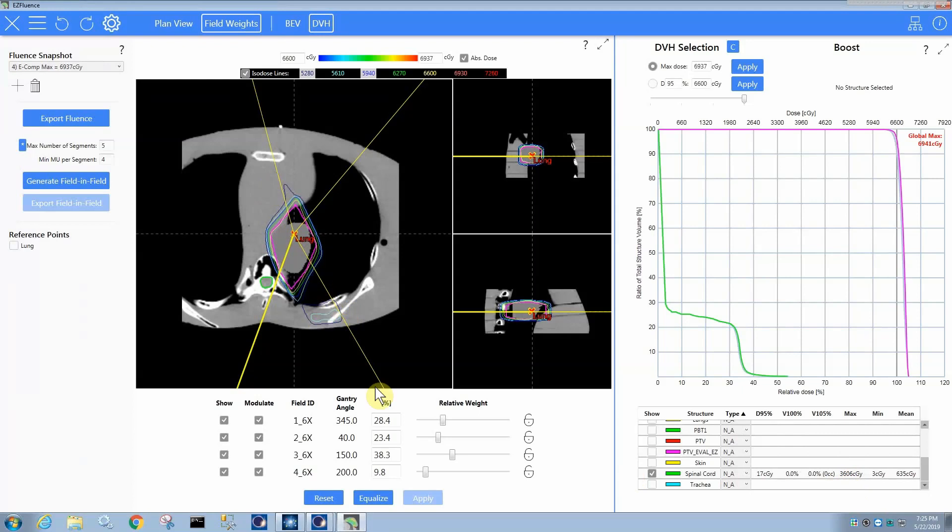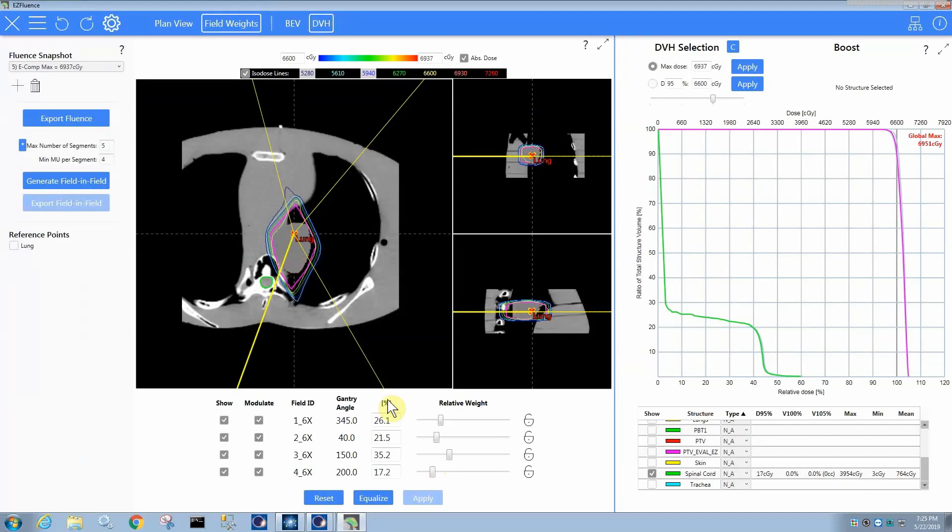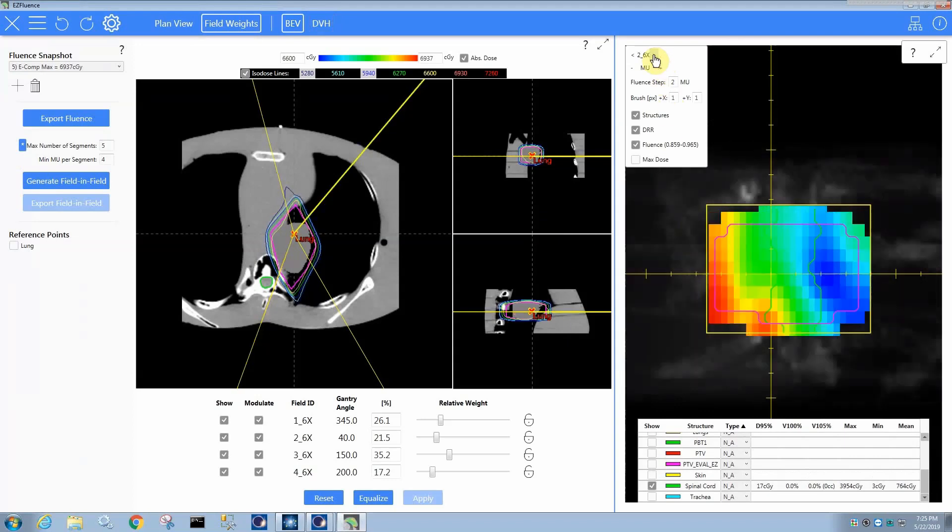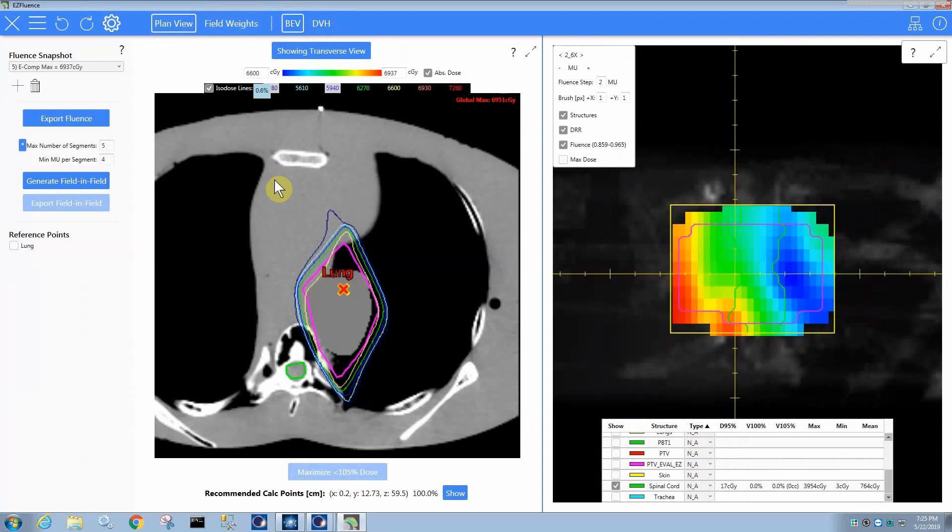So it's very easy then to go back the other way, to try it out, see what you think is the best weighting across them. But every time you hit that apply button, it does this full fluence optimization to where you can then see what the optimal fluence delivery is going to produce in terms of the dose distribution.